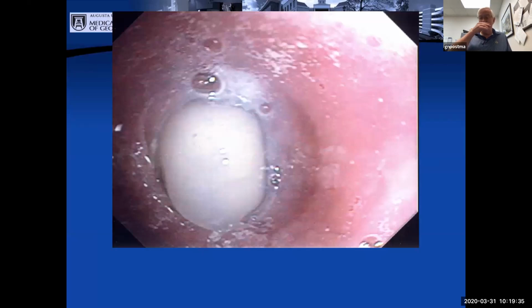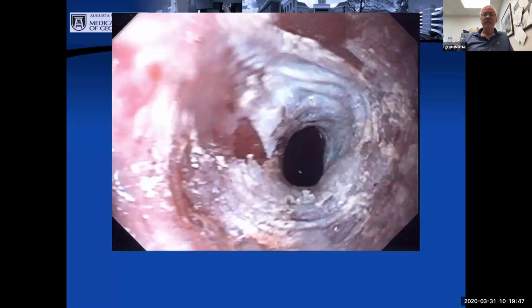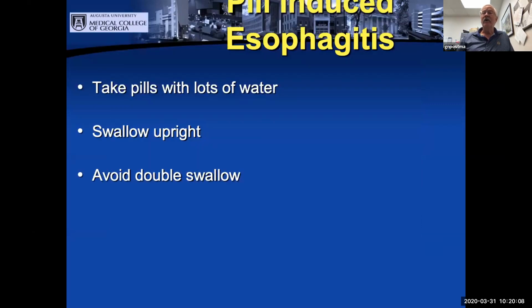This is actually the wife of a former resident that had solid food dysphagia and burning. And so you look in there, what do you see? Impacted medication, pill-induced esophagitis with a stricture. Most common cause of this nowadays is Fosamax, far and away. Ampicillin, tetracyclines, and so forth, or potassium pills were the top before, but Fosamax has now become the number one culprit. And once again, it doesn't hurt to look.